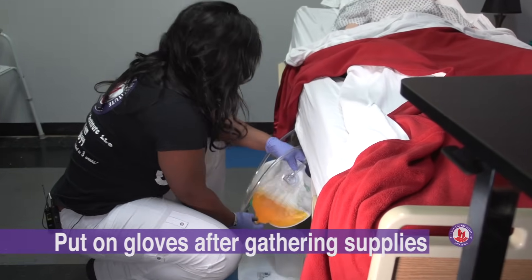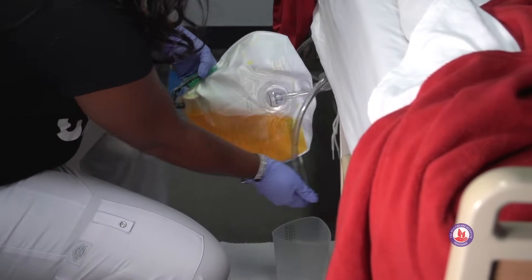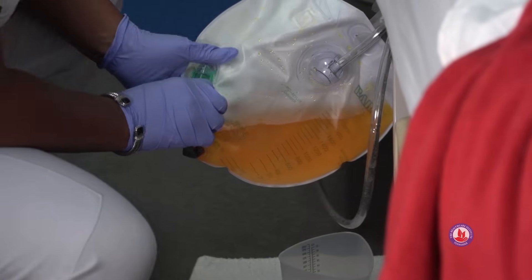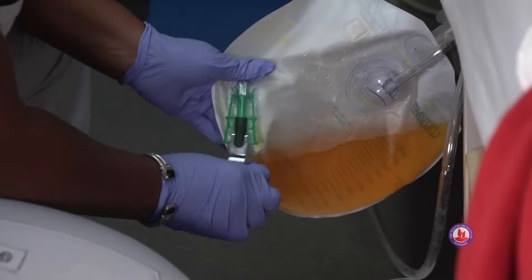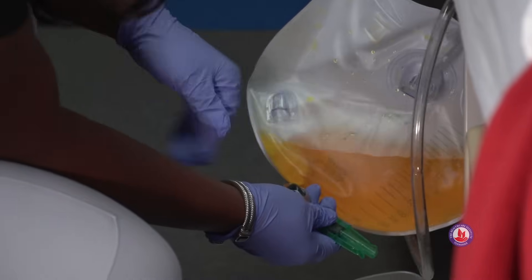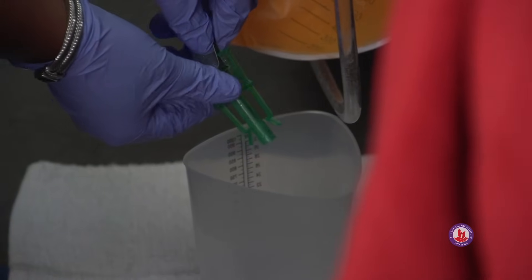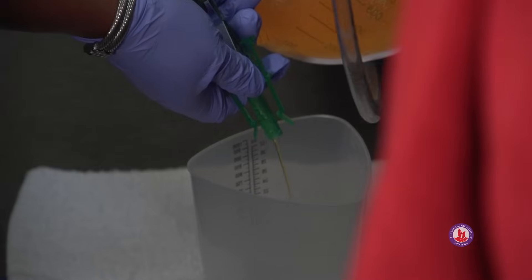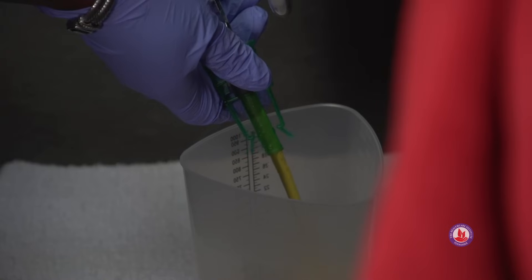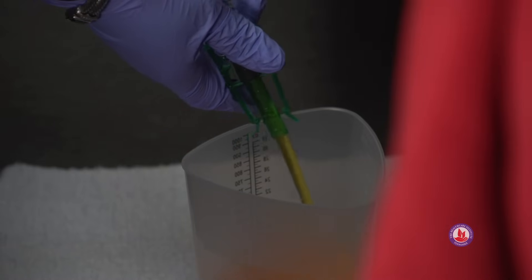There are several different types of drainage bags. This one has a silver clamp on it and there's also another green safety clamp. Some of them just have one clamp. Before we disengage it, we want to make sure that it's clamped — it's clamped now. We'll take the green part out, then we'll unclamp the silver part. At this point, urine will start to flow into the graduated cylinder. We want to make sure we don't touch any part of the cylinder at any time because that's contamination. We're just going to let it drain out until it's completely empty.